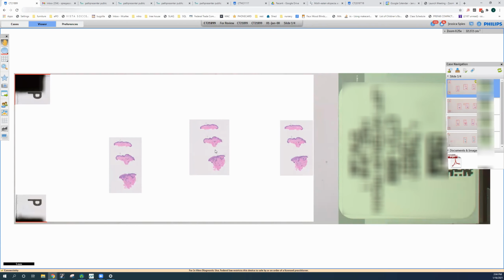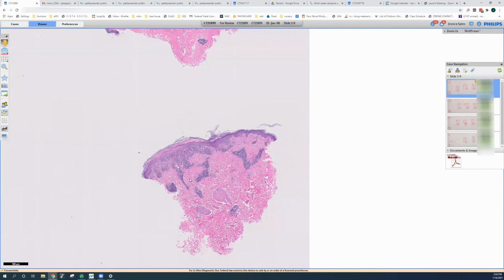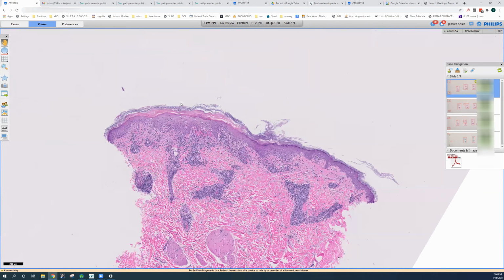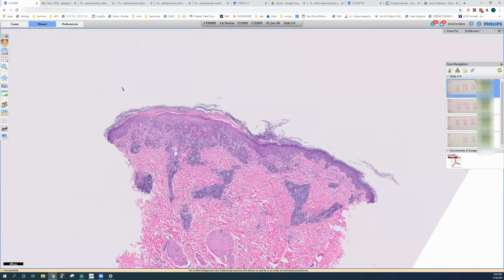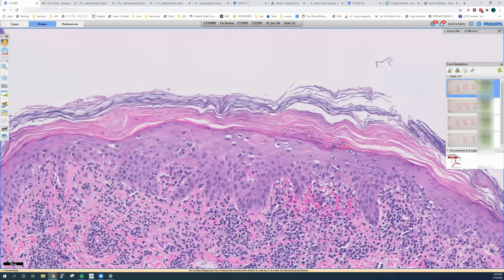And this came in from a clinician who was very good as rule out pityriasis lichenoides chronica. And actually I looked at the slide before I looked at the paperwork, and I thought, this is pityriasis lichenoides. This is a beautiful example of it. You can see here it's relatively acute because there's a basket weave stratum corneum overlying this layer of parakeratosis.